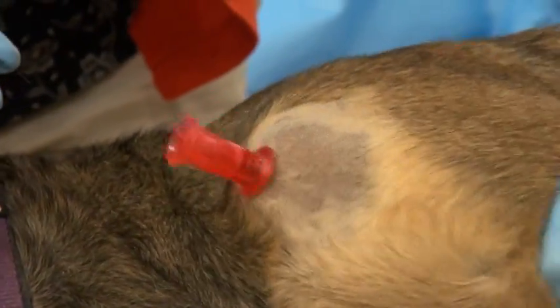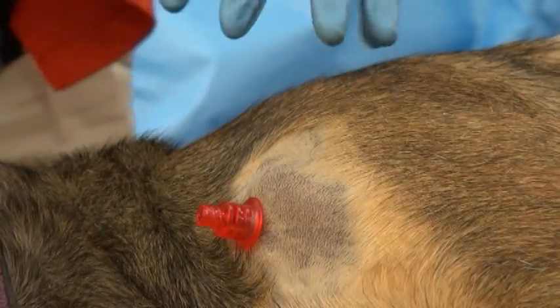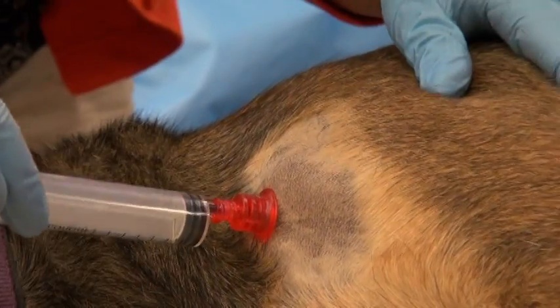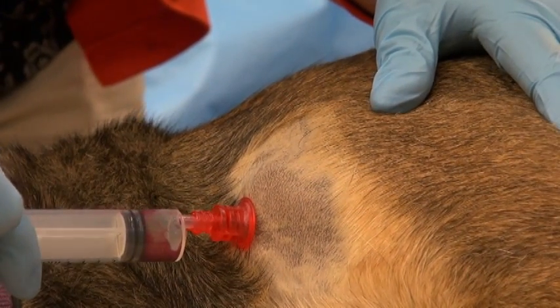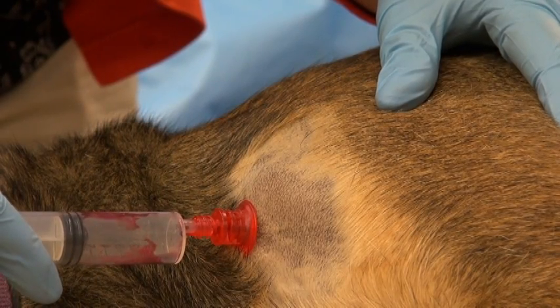This is confirmed by grasping the needle to make sure it's firmly seated and moves with the bone. The drill stylet is removed and a syringe is used to confirm proper placement by aspiration of bloody bone marrow elements.